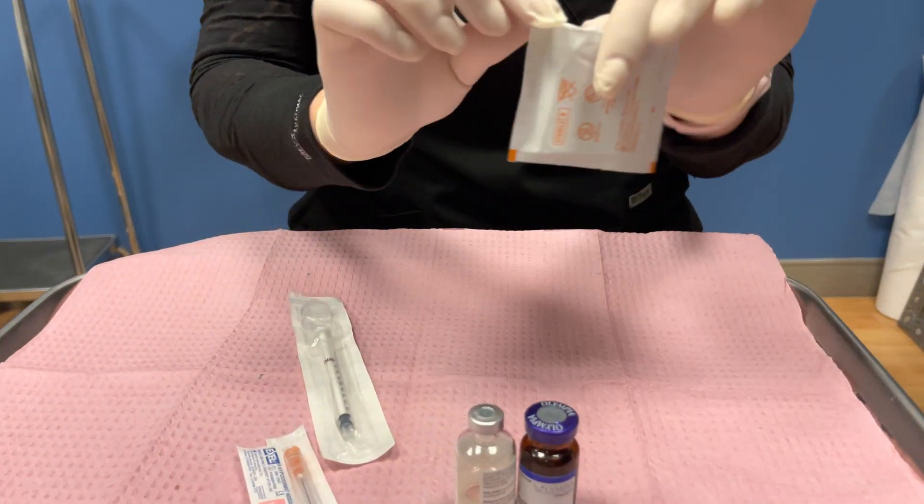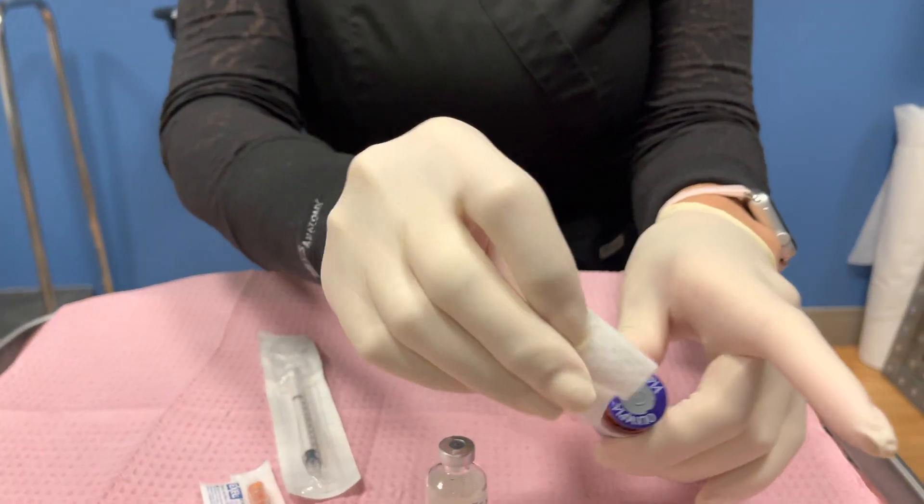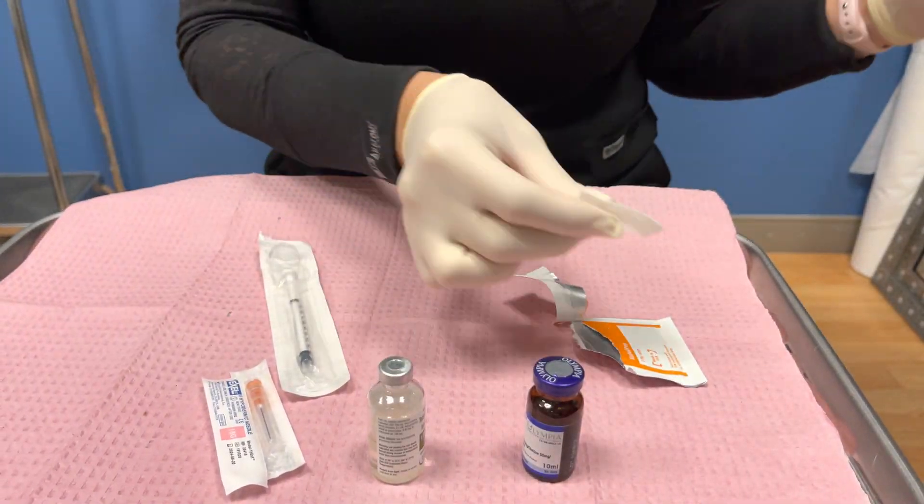So we're going to do the female testosterone today. We're going to first take the alcohol swab and you're going to clean each top of the vial. One little swipe. There you go.